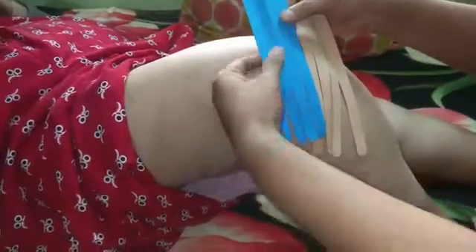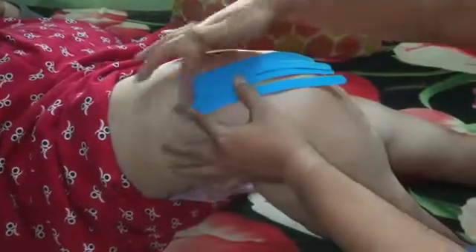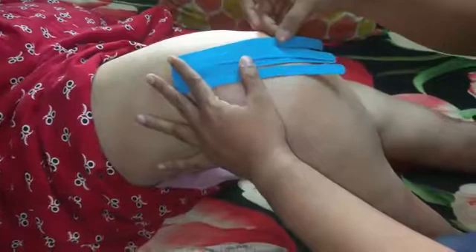The technique for reducing swelling involves putting the tape into components like this, and the affected area — the knee — is kept in flexion. The tape is essentially going to go in the direction of the lymph nodes where it is going to be draining.